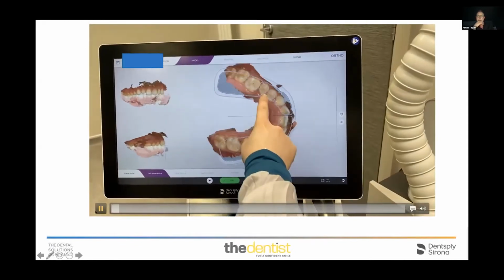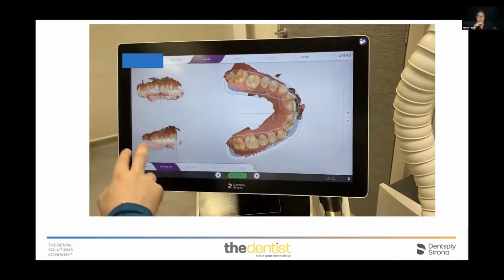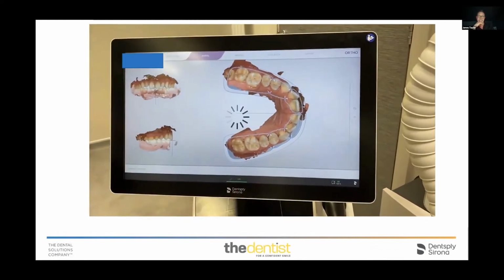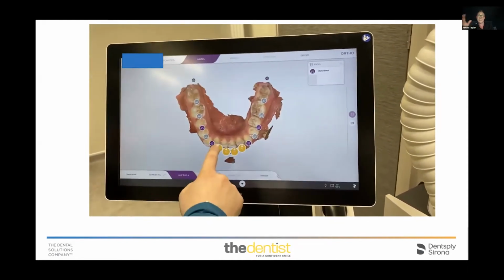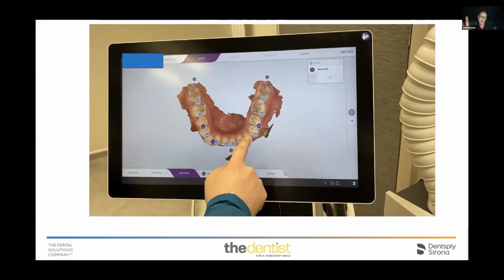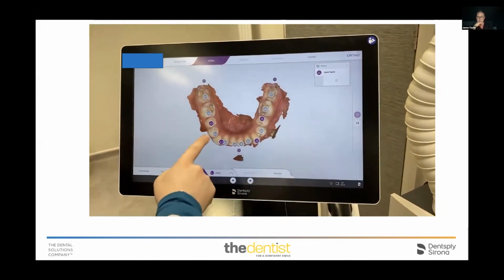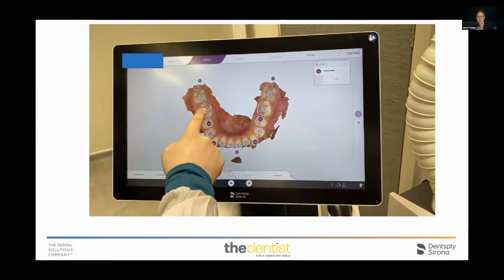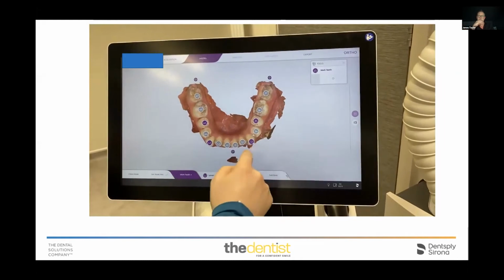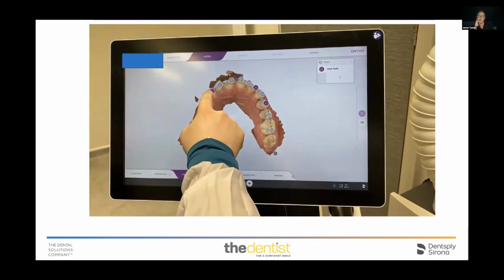This video is after I've taken the scan, showing you how we would then move forward to actually putting the scan into CEREC Ortho, and what you would need to do to then send the scan off to SureSmile. So I've scanned the teeth. I'm identifying each tooth with a number as per the tooth. It's very intuitive and very quick to nominate the appropriate number to the tooth, doing the lower arch first, then moving to the upper arch.